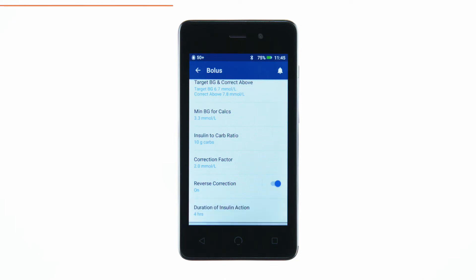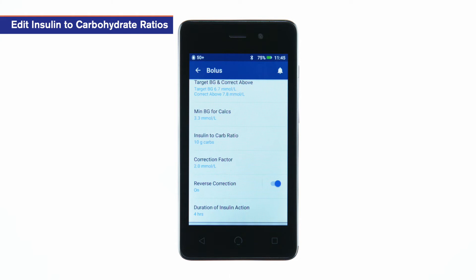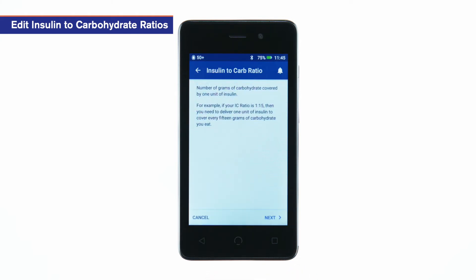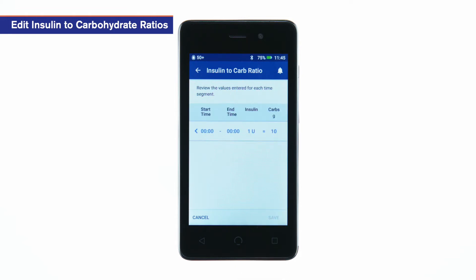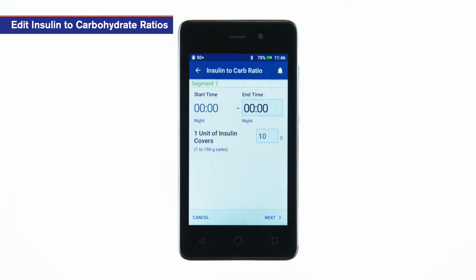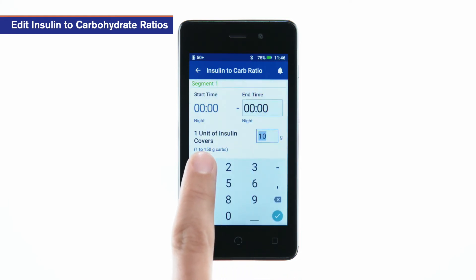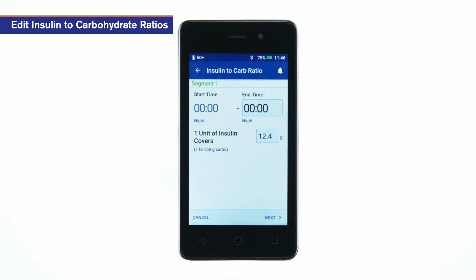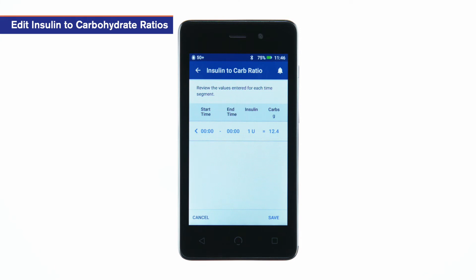To edit insulin to carbohydrate ratios, tap insulin to carb ratio. Review the description of insulin to carb ratios and tap next. Tap the segment you want to edit. Enter the end time and the IC ratio value. IC ratios can be fine-tuned in one-tenth increments. For example, one unit may cover 10.2 grams of carbohydrate. Tap next. Repeat these steps as needed for the remaining segments. After confirming all segments are correct, tap save.